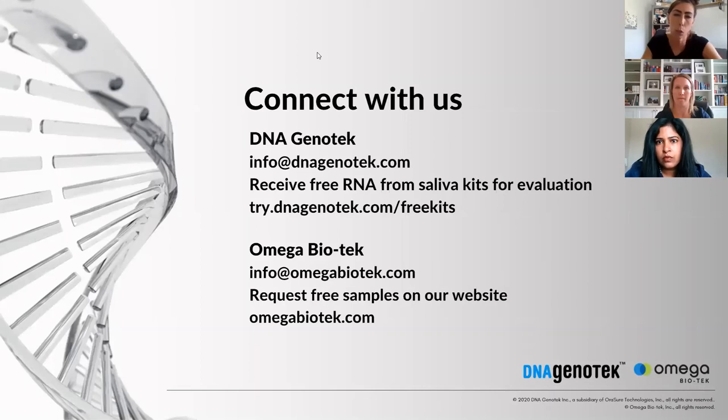Okay. And then the next question is, are there collection kits capable of inactivating the virus, like Triton X-100, that also preserve viral and/or cellular protein 3D structure? Yeah, I did mention in one of the questions that came through as a typed answer that our chemistries are detergent based for these products. That is how the inactivation is occurring. In terms of keeping an intact cellular 3D structure, this particular chemistry is not doing that.